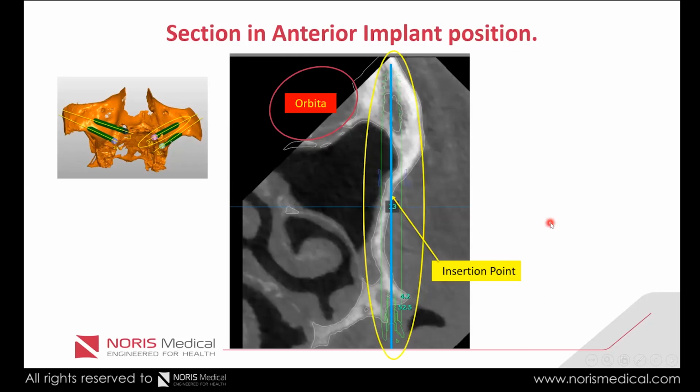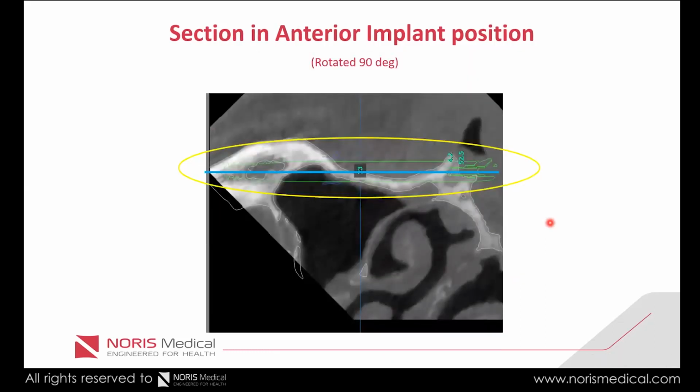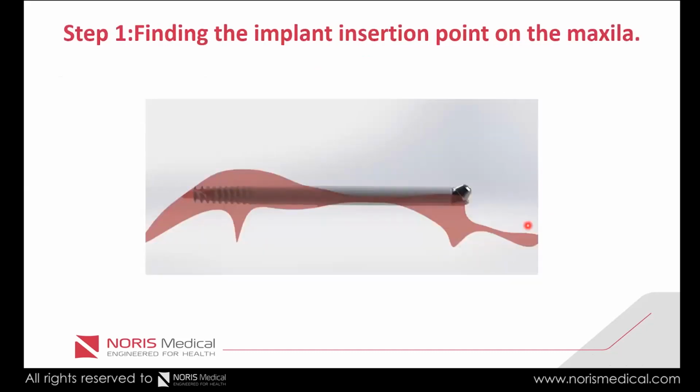So actually, I will be rotating this picture because I'm going to a model that will help us understand. Okay, this is a model. It's not actually correct in terms of the bone, but this is the model of showing us a zygoma. We see the sinus, we see the alveolar ridge, and we see the multi-units.